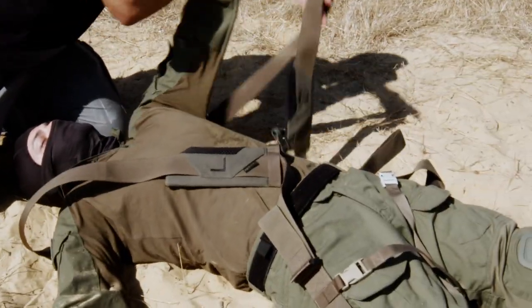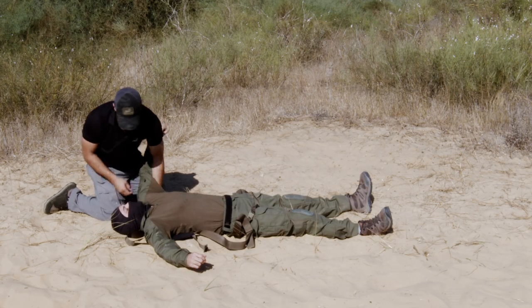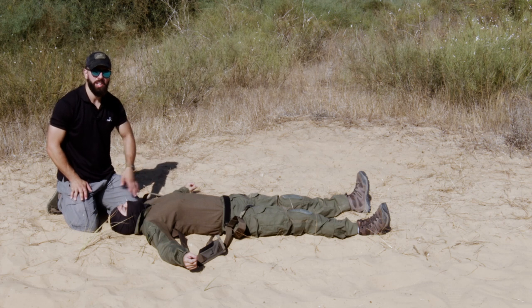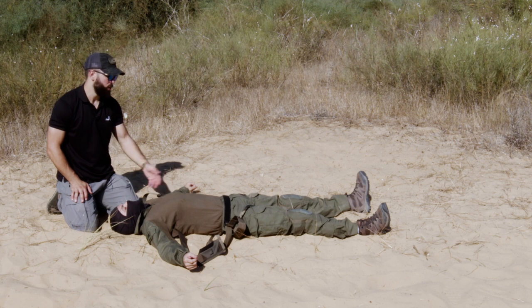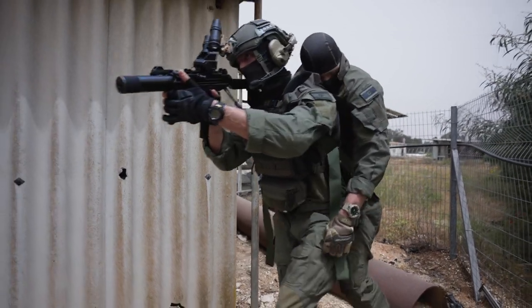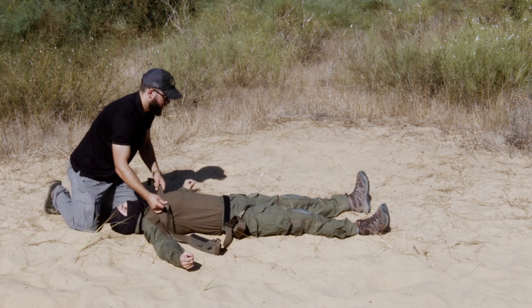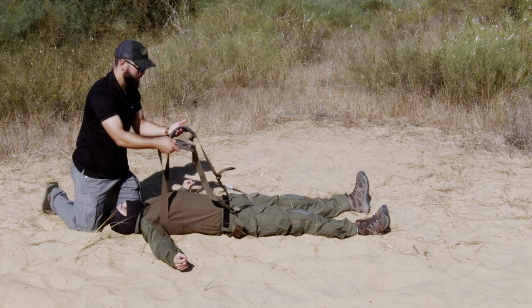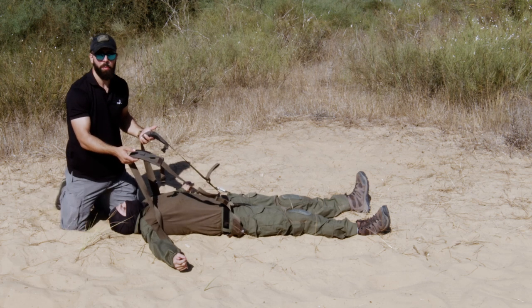Start by putting it under his arms, lift him up a little and get it right over there. Obviously, if you have any suspicion of neck or spine injuries, you're not going to want to use something like this — you'll need to keep the person immobilized. This is more for situations where you could otherwise use fireman's carry, or where you have absolutely zero option but to get the person off the X. Once this is on, that's secure. Put these up into his armpit — now you can see how it's going to work. These are the shoulder straps, the sternum strap over here. We've basically turned them into a backpack.